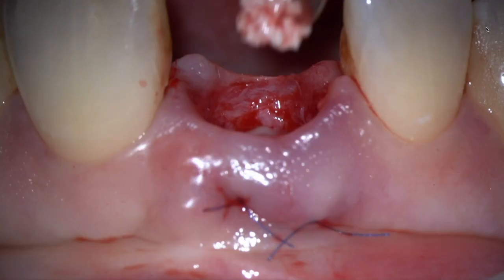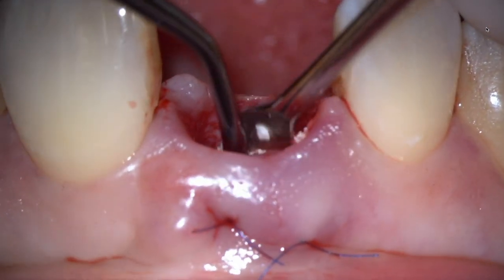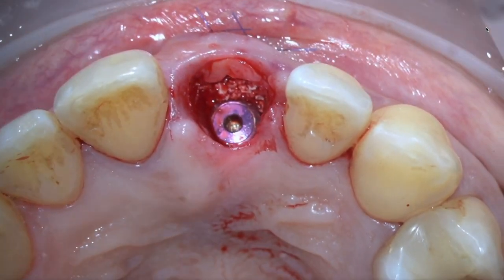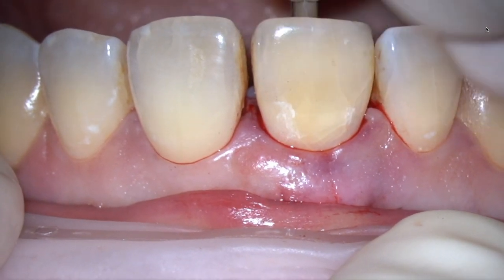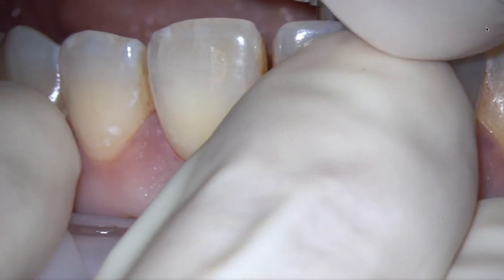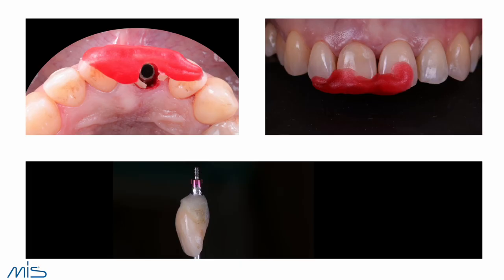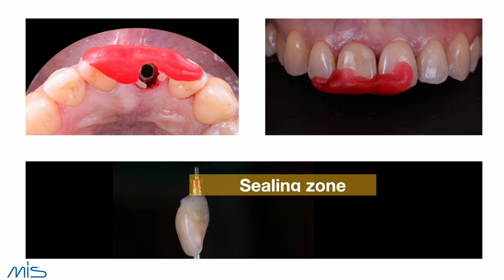Additionally, we can use bone in the gap. First I put the cover screw so bone particles don't go inside the connection, then use the plugger to place bone in the frontal gap. This is the crown reattached to the implant component exactly in the position it was before surgery. To achieve that we need the jig to locate the initial position, and a certain depth to achieve two millimeters of polished titanium used as a seal zone.